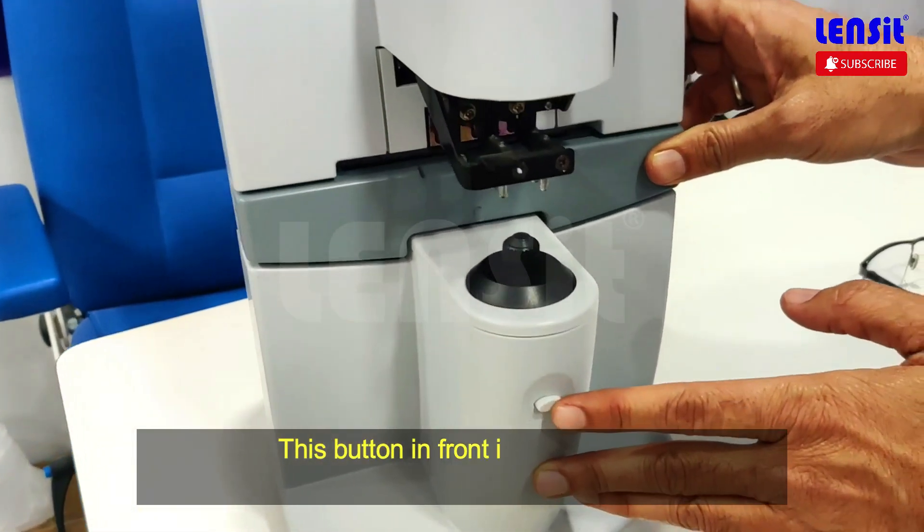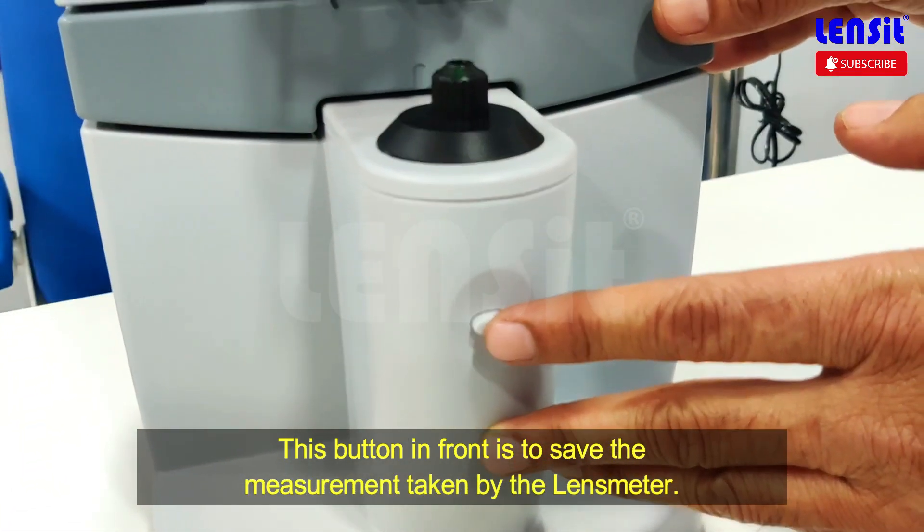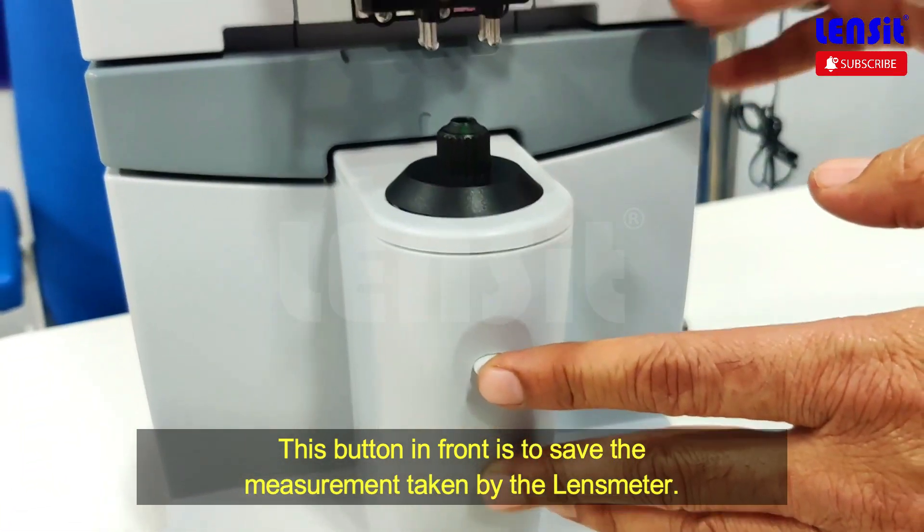This is a save button. You can press this button and save it.